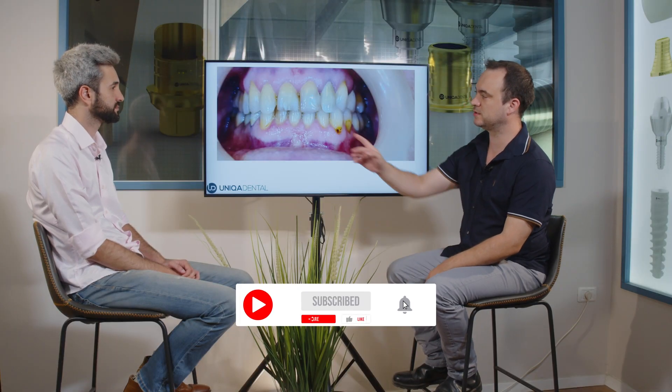Anterior teeth. This incisor had a very large anterior restoration. Both of the laterals are crowns that we already did some orthodontics and moved them. The anterior restoration fell and we wanted to make a bridge on all four units. It looks broken — about half a tooth is a restoration. Because we already have a couple of crowns, we want to prepare the teeth and make something more permanent.